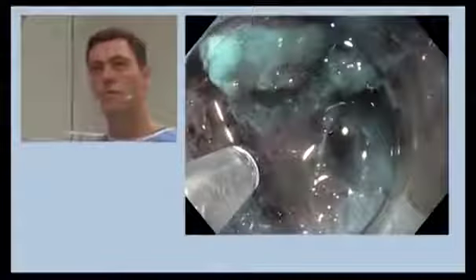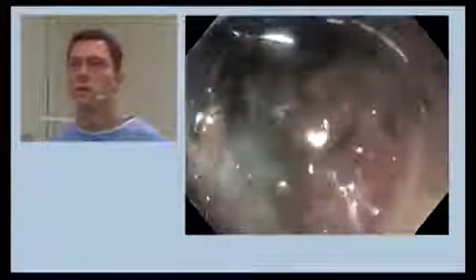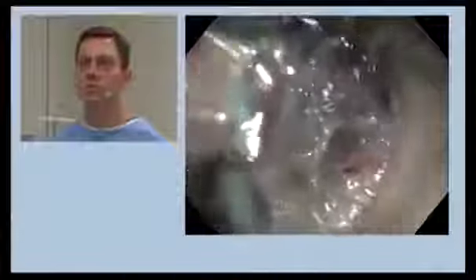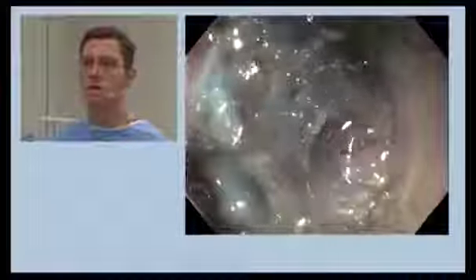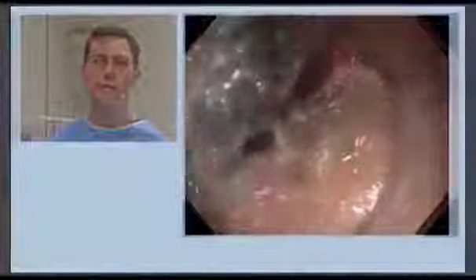Extend it, please. Inject. Inject again. Okay. And needle in. And now we'll take the knife. Now we're orienting ourselves towards the right edge. And there we can see how the circumference runs. And that means we're safe. We keep picking it up piece by piece. And here we transect this small.